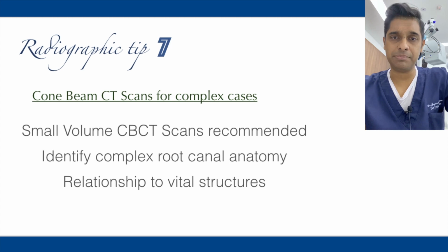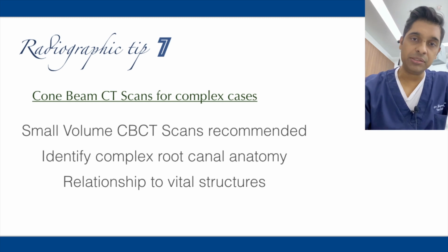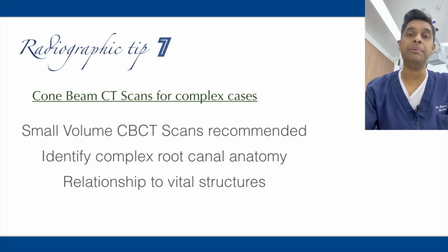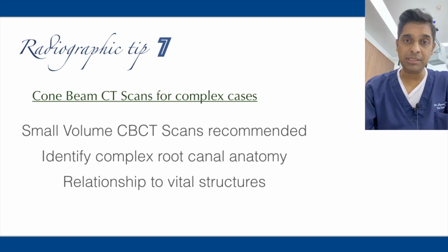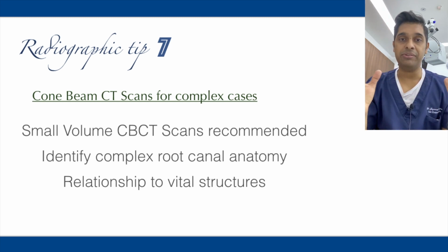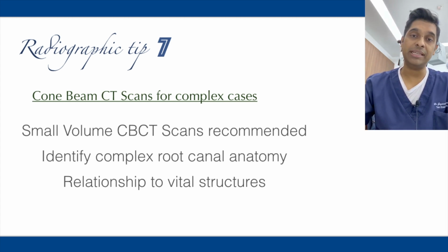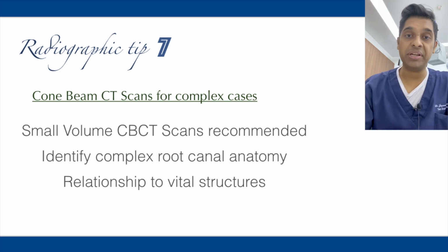What about the next tip? The tip on using cone beam CT scans. I highly recommend you use small volume CBCTs for your endodontic diagnosis, your treatment planning, and all these purposes. In case you have complex root anatomy, CBCTs will really help you, and also to assess the proximity of vital structures. You have a huge lesion, you have the inferior dental canal, you want to know if you're already there, or if there is an infection in the maxillary sinus from an endodontic origin. There are so many other reasons like these. So CBCTs really come in handy.